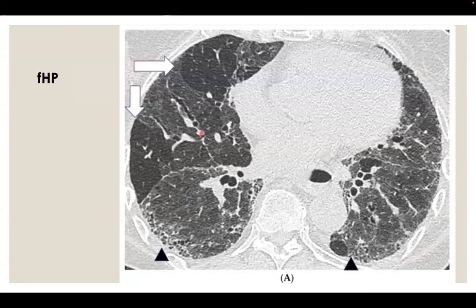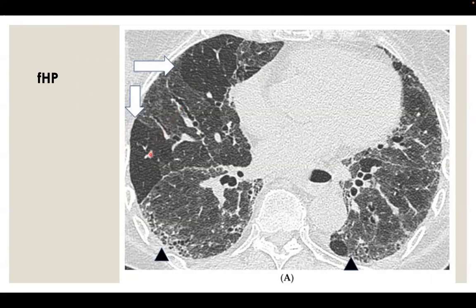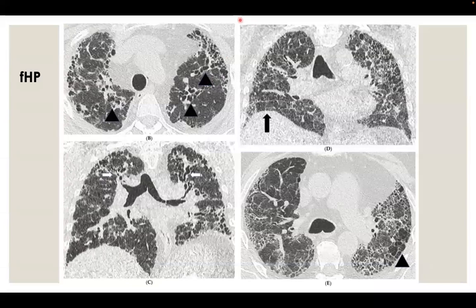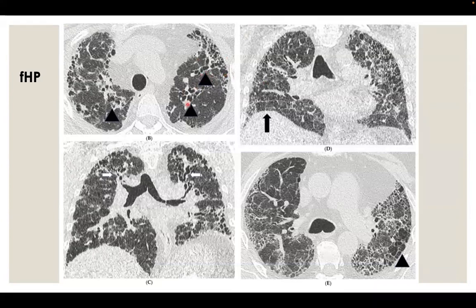What if we have a typical UIP pattern with features suggesting non-IPF, like fibrotic hypersensitivity pneumonitis? If we can find lobular air trapping within the upper lobes, this is a feature of fibrotic hypersensitivity pneumonitis. Air trapping is allowed to be seen in IPF UIP in the lower lobes only, not within the upper lobes. Another feature of distribution suggesting the typical UIP pattern is non-IPF is the presence of bronchocentric distribution of traction bronchiectasis, as appreciated here.